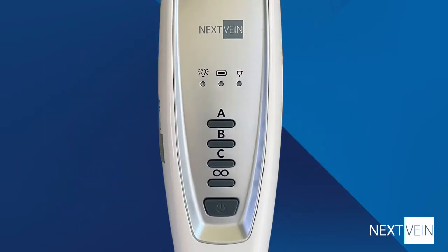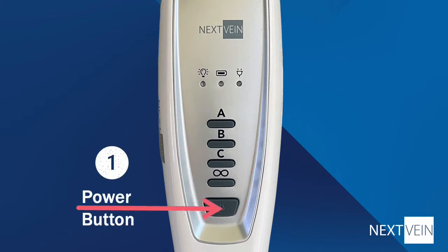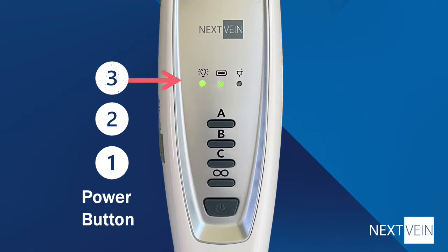The handheld device has three status indicators and five buttons. To turn on the device, press the power button for three seconds. You'll see the indicators light up once the device comes on. It will take a few more seconds for the projector to start showing veins.